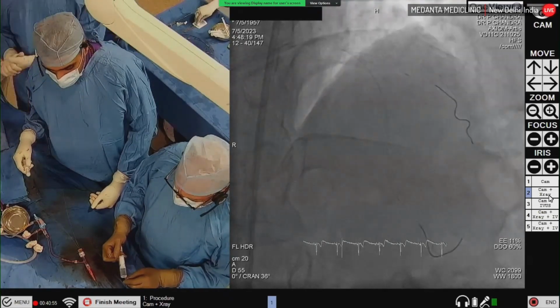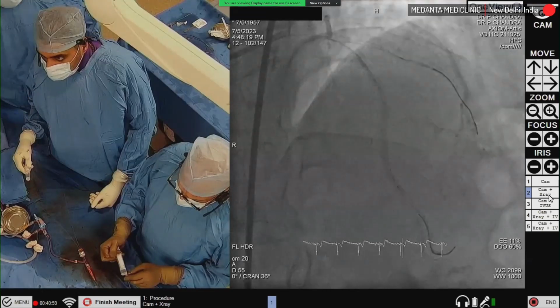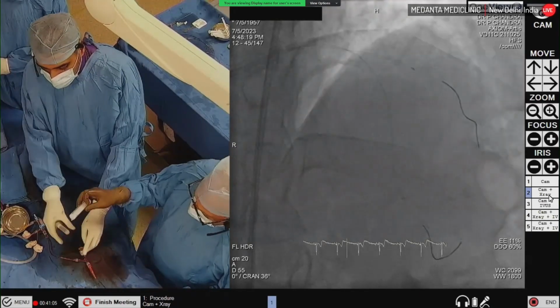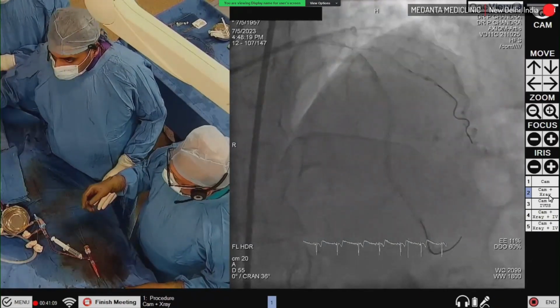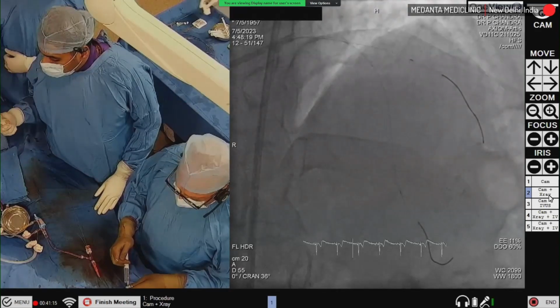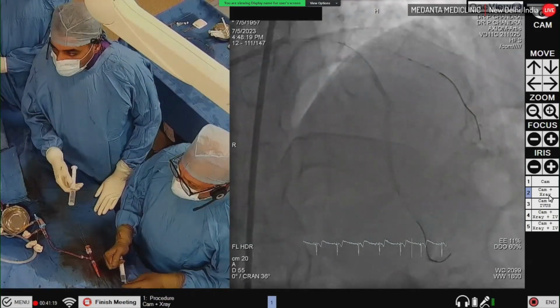If the calcification is ring-like and more than 180 degrees or deeper in nature, in these cases we definitely take a Wolverine. But sometimes, if we are not able to cross, as you saw, in an ostial location, we first dilate with the Scoreflex, which is another type of scoring balloon. So this is what we do.